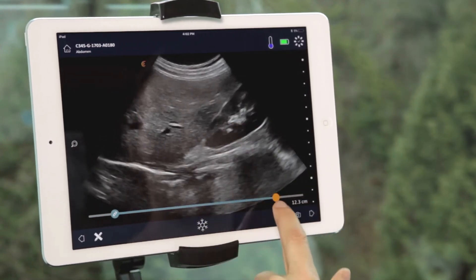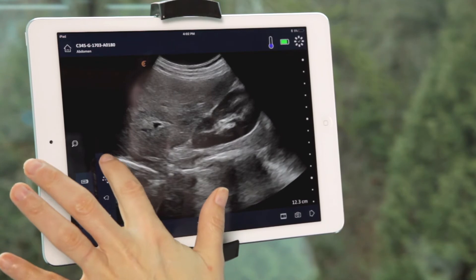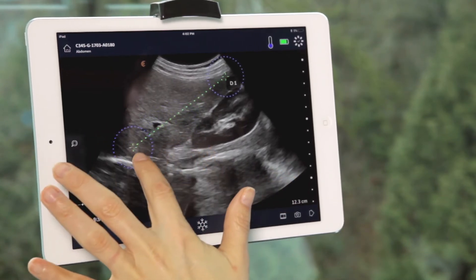To make a measurement on a frozen image, press the ruler icon and then select a measurement type. Place the first marker, then the second marker. The measurement value shows on screen. You can move the markers by holding and dragging to their location.